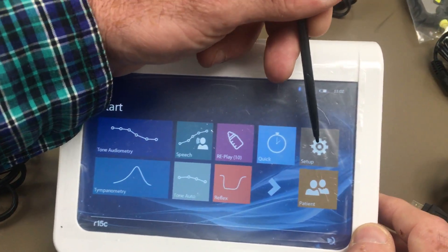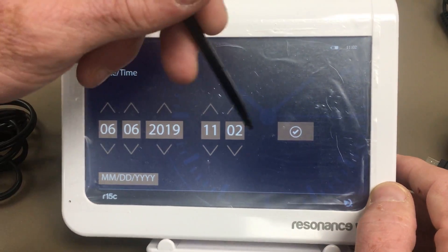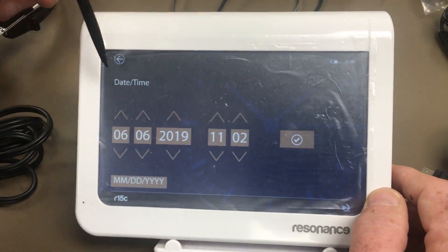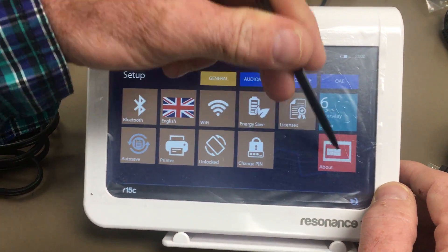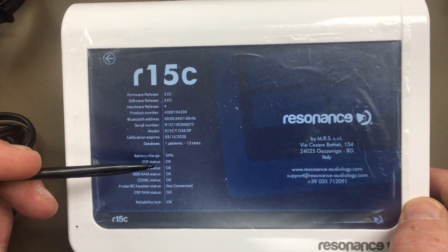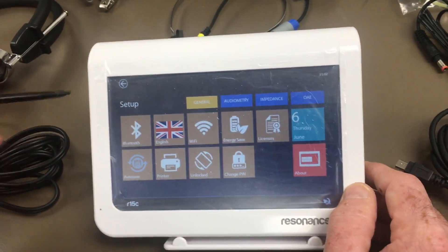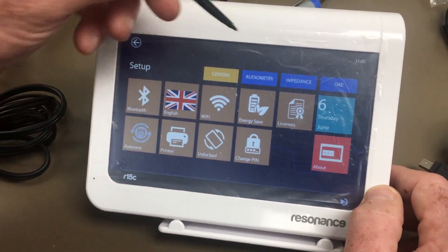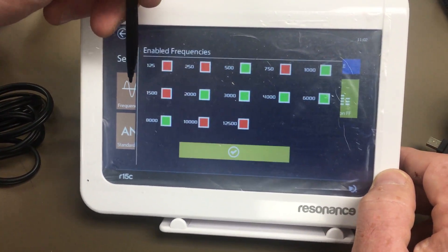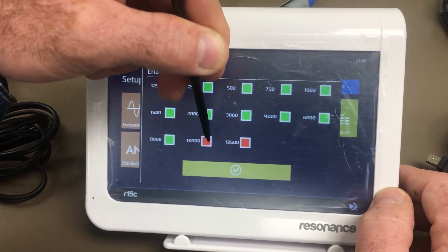The first thing to look at is the setup. You can customize the date format — month, date, year — and the setup screen also tells you how many tests you've stored, when the next calibration is due, your battery percentage, and more. In the audiometry settings you can turn frequencies on and off, whichever ones you want. The only frequency you cannot turn off is 1000 Hz.